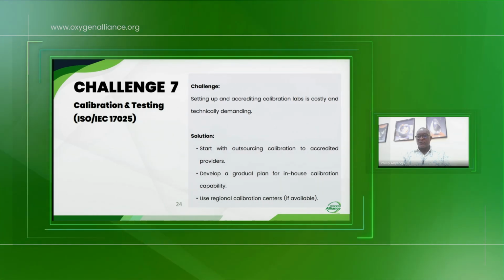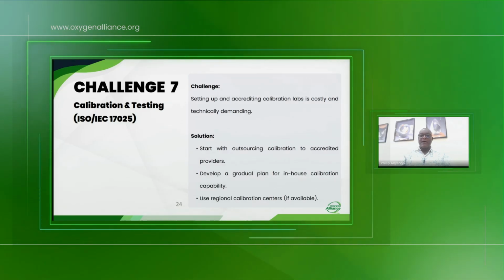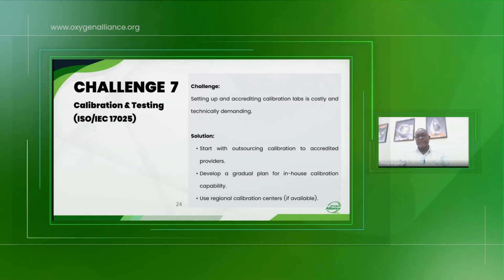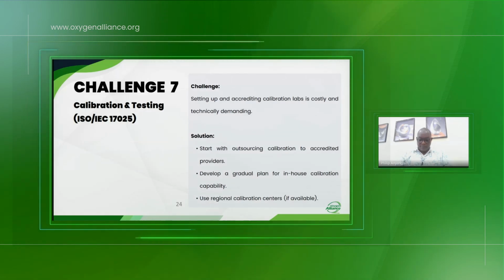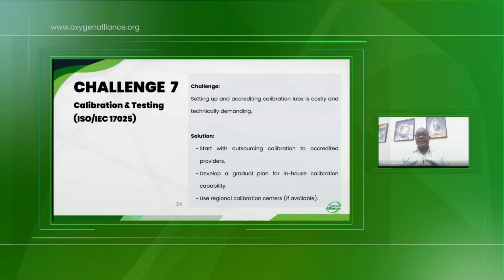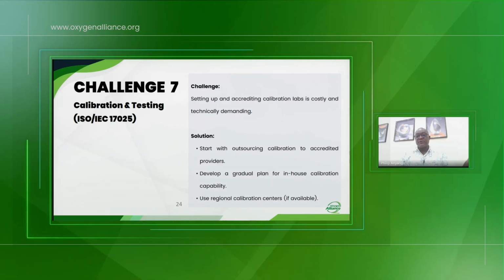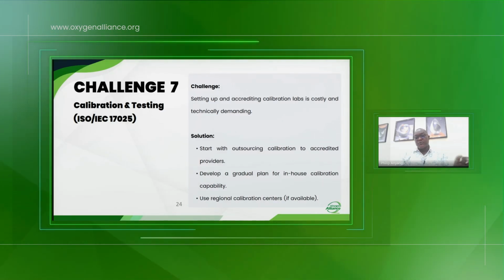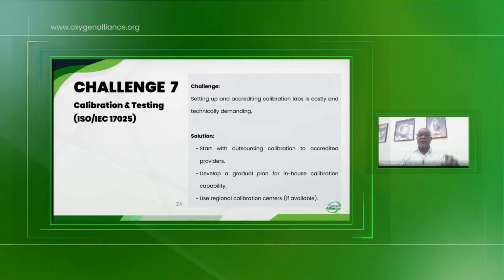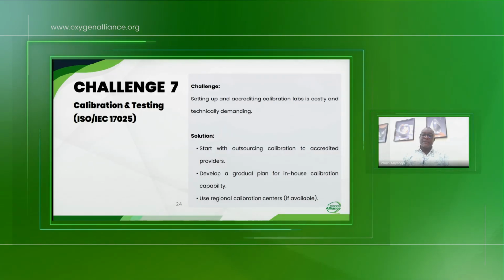It just shows that you have done the maintenance, but when you go back to the history of the equipment, it will not be able to give you that. But the CMMS is for a complete hospital. It will give you the inventory of the entire hospital equipment and medical devices. And in fact, you can as well use it for facilities management.